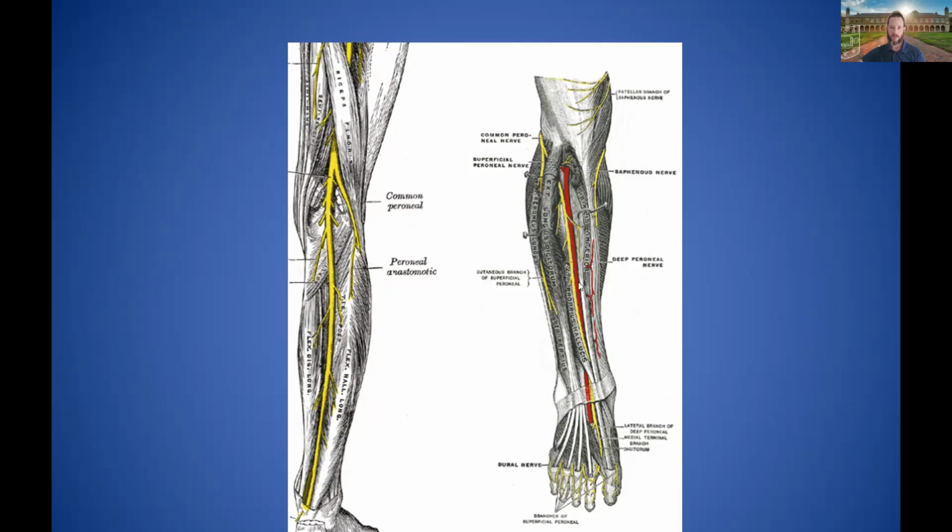coursing with the anterior tibial artery, which in the video, I apologize, I misidentify as the deep peroneal artery. I just got tripped up on my words there, but you'll hear me misidentify that. And then here, the distal division of the deep fibular nerve, and I'll show you a video of that location also.